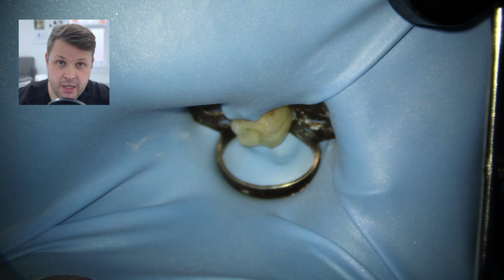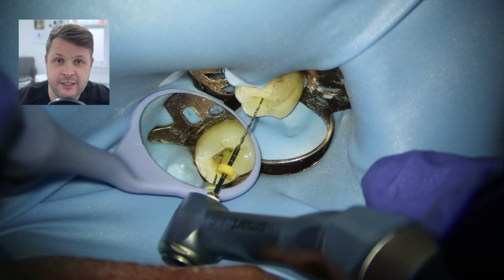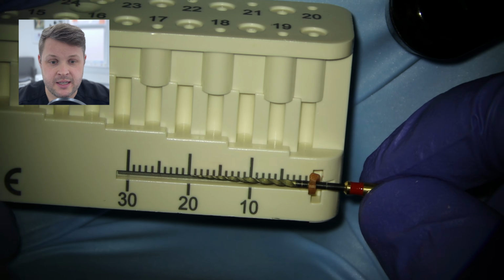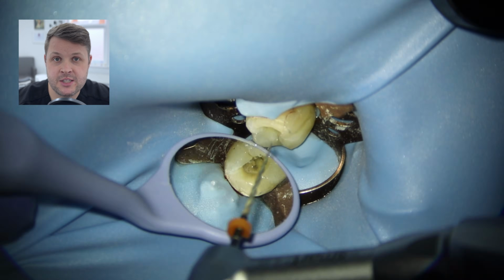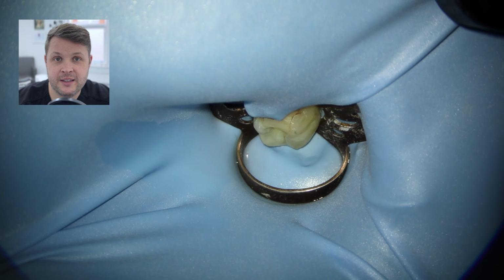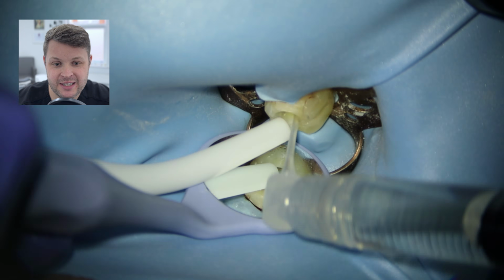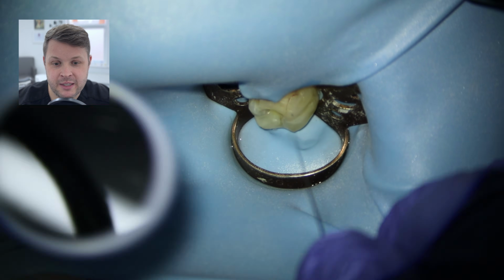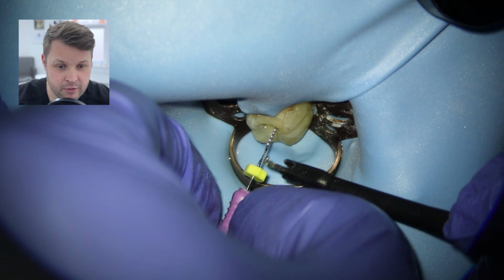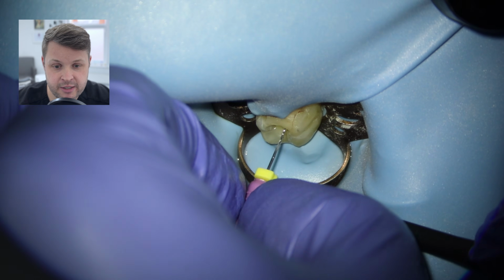Once we've done the orifice opener, we're going to use a 1503 high flex glide path file, and we're going to obviously shape this up to the point where we have got with our hand file. And again, we're going to use the size 25 variable 0.5 millimeters away from as far as we can get, and then we do a nice little bit more irrigation. Always irrigate, it's really, really important.